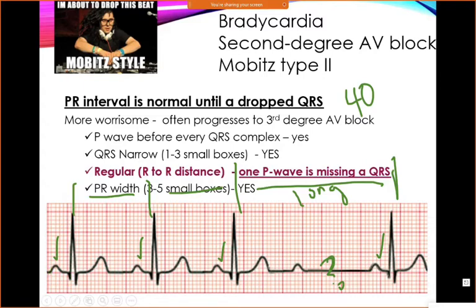And we actually use calipers on the computer. We have these fun little devices that will mark this for us. So basically we're going here. Let's see, 1, 2, 3, 4, 5. We're going to stick with 5 there.